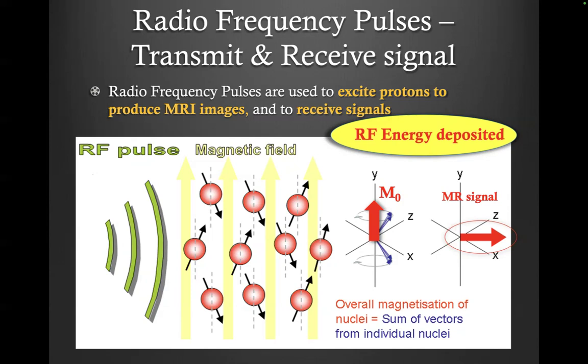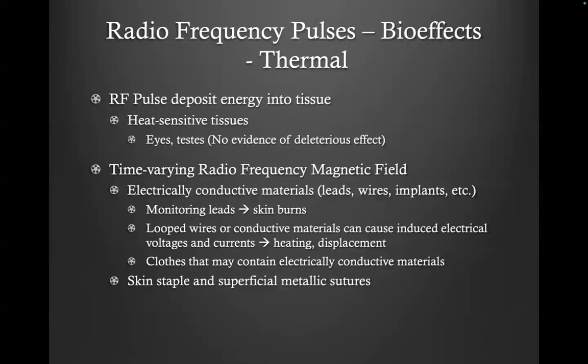Another issue with a large participant is that there's a lot of RF energy, because you have a lot of proton signal to excite. So there's going to be a lot of energy deposited, and you are more likely to run into heating problems, et cetera. So the bio effect, of course, is heating, or the thermal effect.